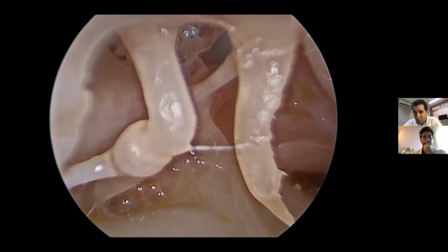One of the most important lesions you can cause is thermal injury related to heat. So you should never use the light source at 100%, because you can transmit heat, and with close-up views you can burn the chorda, the incudostapedial joint, and the tympanic membrane, and cause some real problems.